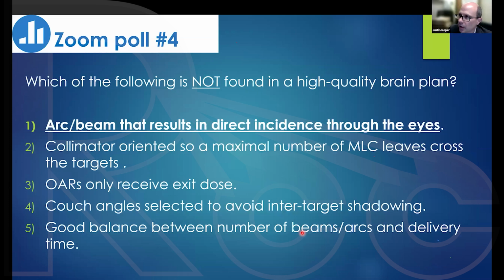And Jose, along that thought, does the lack of robustness mean that a plan looks good on the treatment planning system, but it's not able to pass the QA about being too complex or too demanding on the machine? That is, these MLC apertures are getting smaller and smaller where the beam modeling is not quite as good, and that's why the QA pass rates go down?